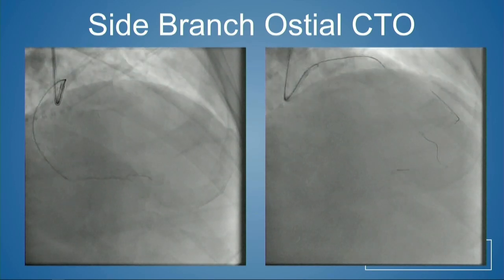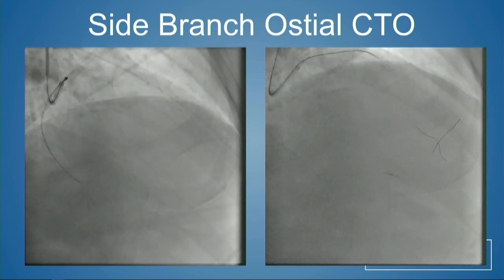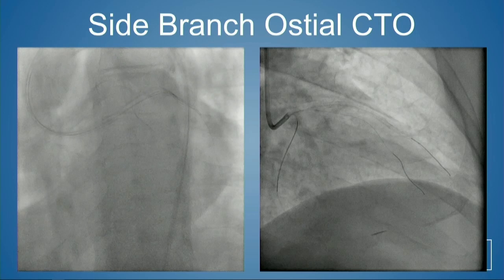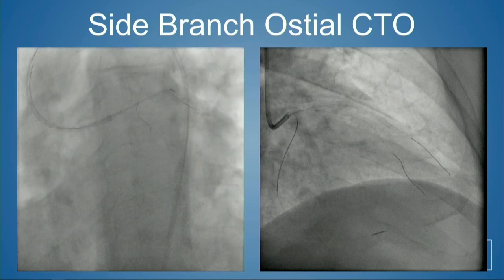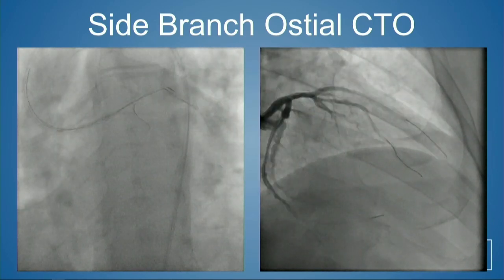Again, this was done only after an extensive informed consent, given the high-risk nature of this epicardial. And with this, we were then able to rewire into the vessel, back into the LAD using a reverse CART, and we got an excellent result.